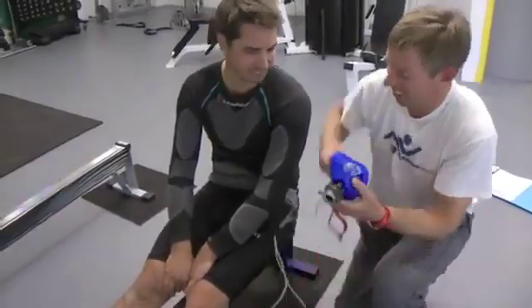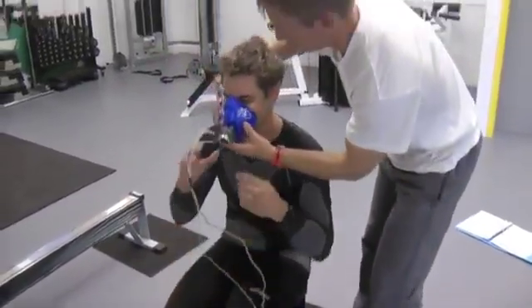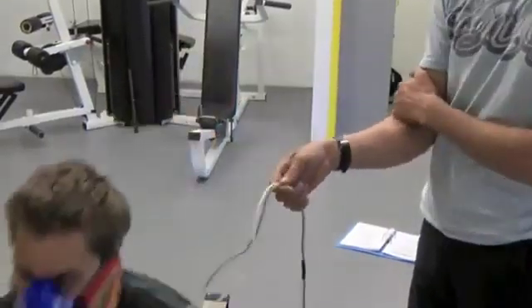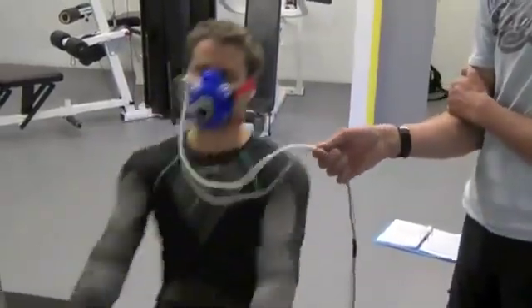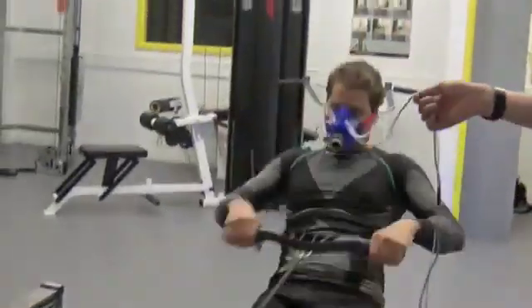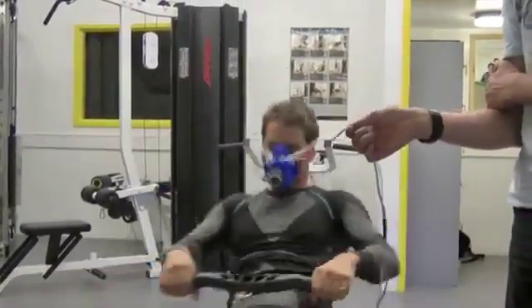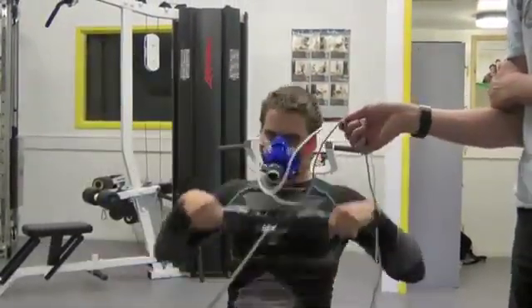Happy with that? Looking forward to it. Okay, let's get the mask on. Can you hold that in place? Looks good, Marion. Keeping it in a 1.37 split.